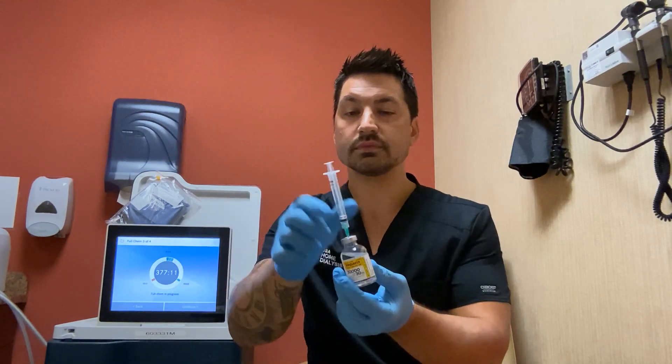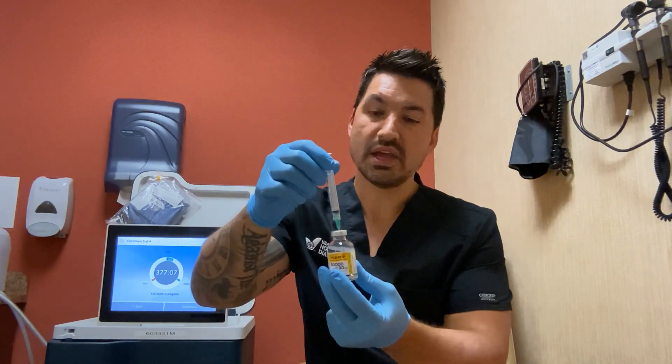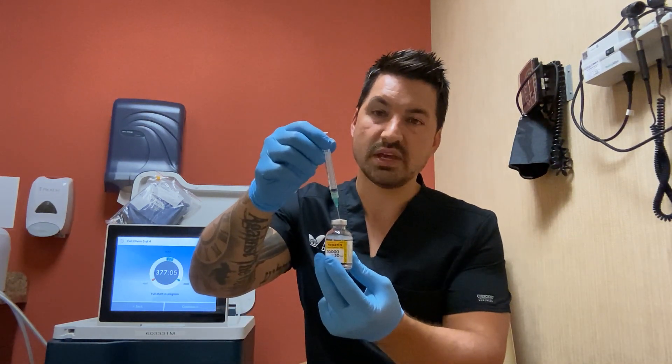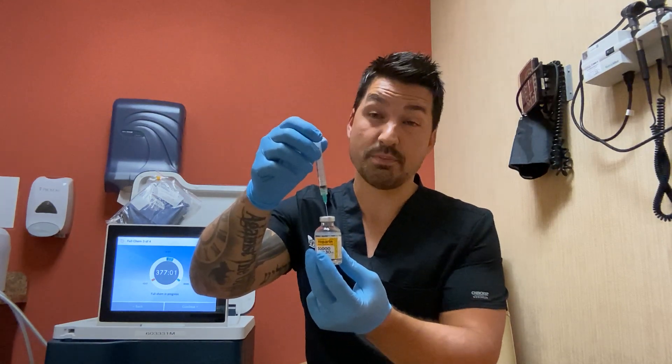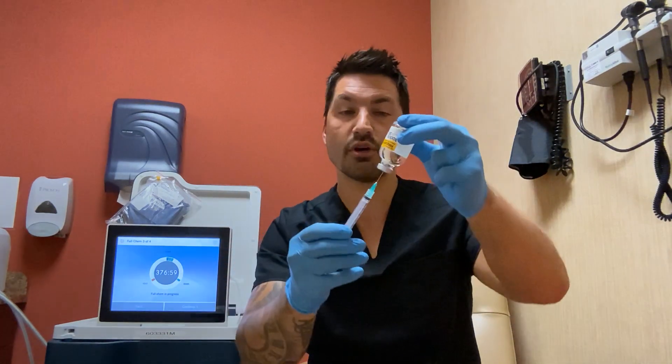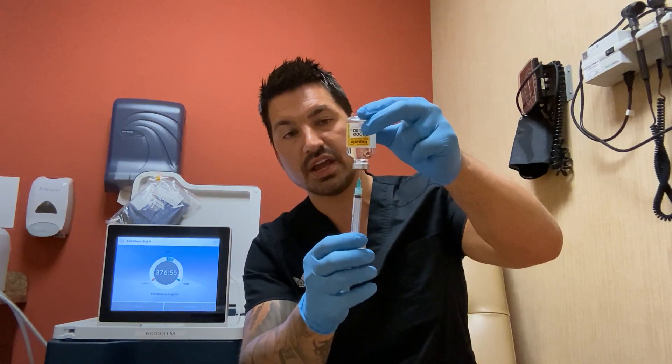Advance the needle straight down into the medication. At this point, invert the medication upside down. The reason being is you don't want that needle suspended in the air bubble that's in the vial and drawing up that air. You want to invert it and make sure the needle is totally covered by the medication you want to pull up.